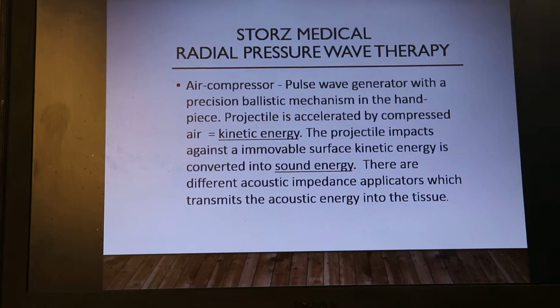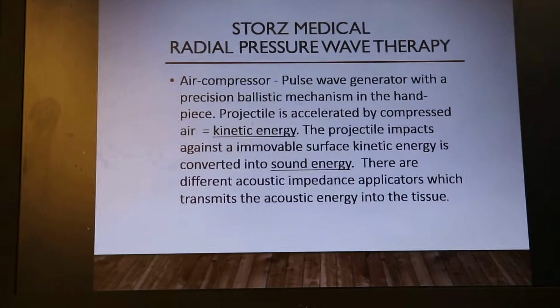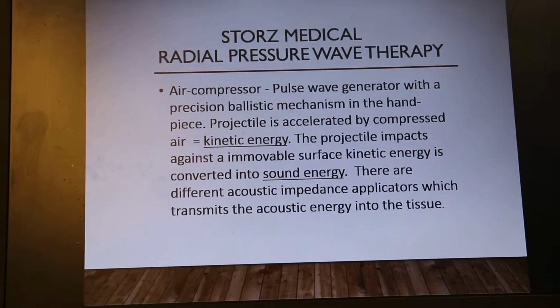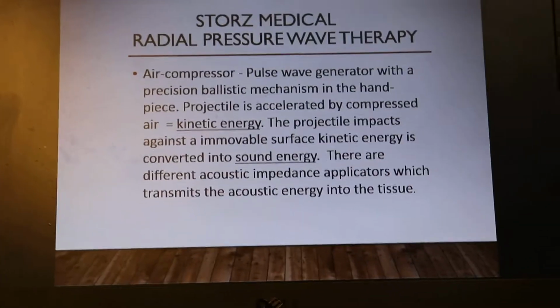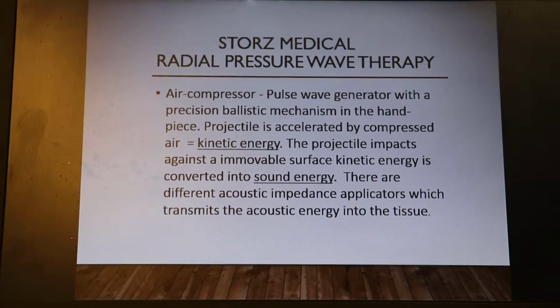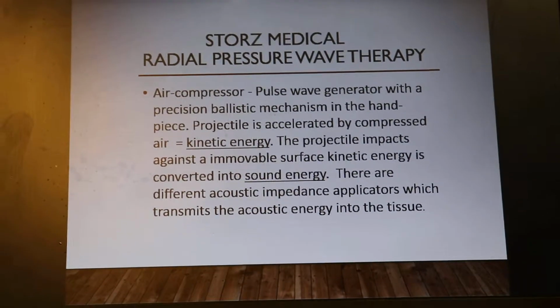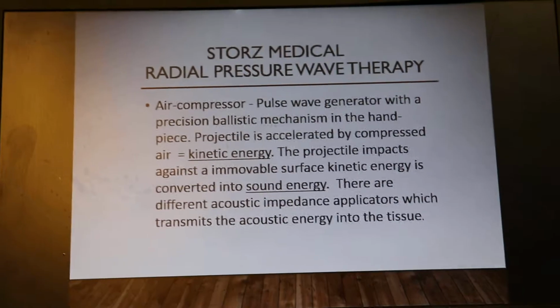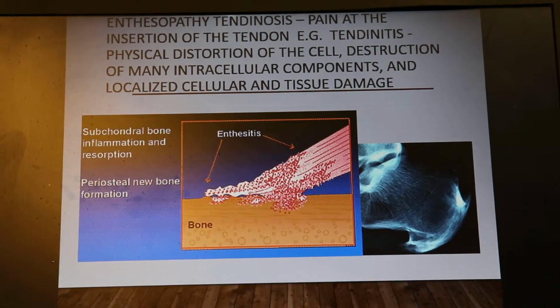Again, a precision ballistic mechanism in the handpiece. Because of this projectile, which is accelerated by the compressed air, it converts to kinetic energy. The projectile impacts against this immovable surface. The kinetic energy is then converted into sound energy. There are different acoustic impedance applicators which transmit the acoustic energy into the tissue, which we're going to look at in a minute.